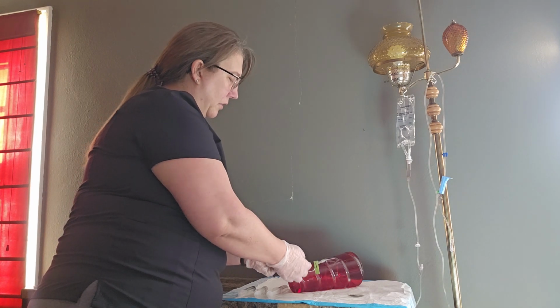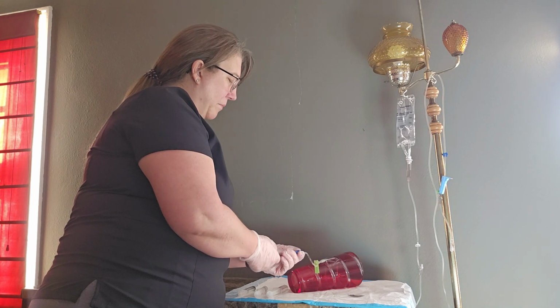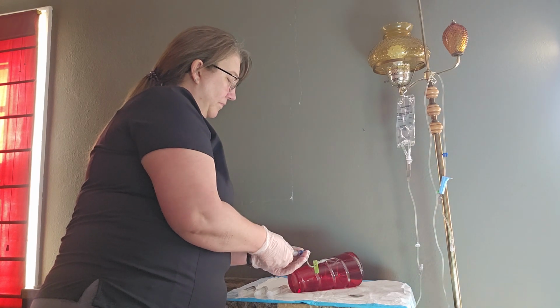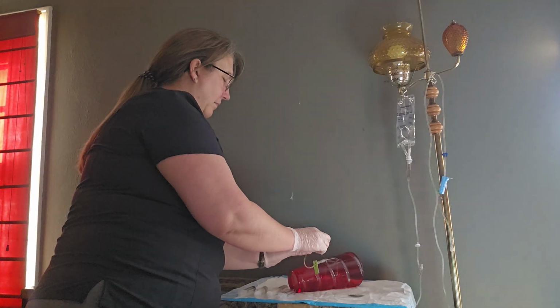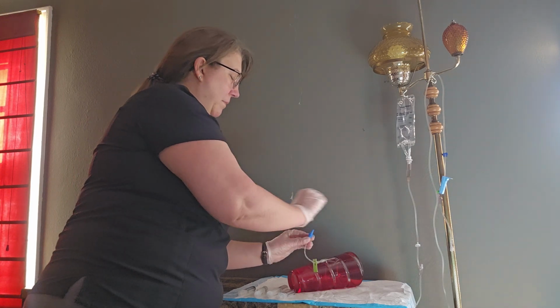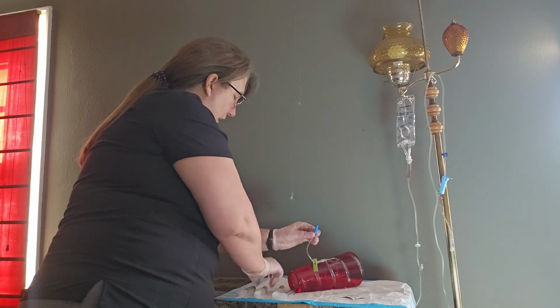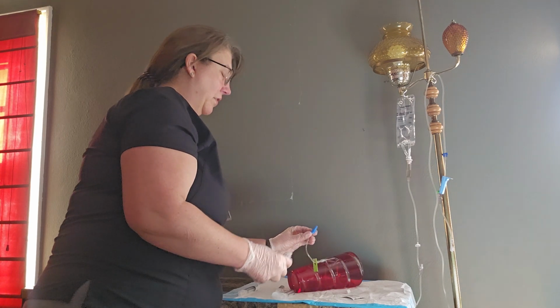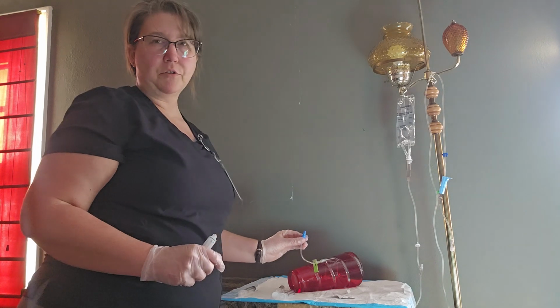I have a good blood return. And then I'm going to insert about 3 to 5 milliliters of saline into the J-loop. And then I'm going to take my antiseptic wipe and scrub the hub again. But this time, I'm going to take my medication, take the cap off, scrub the hub, and allow it to dry.